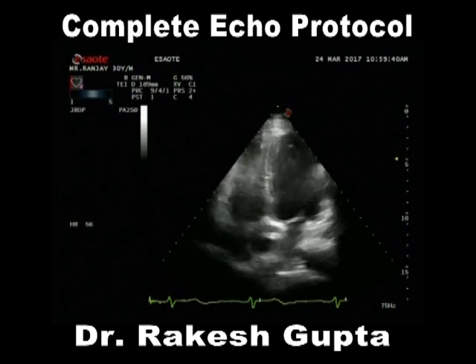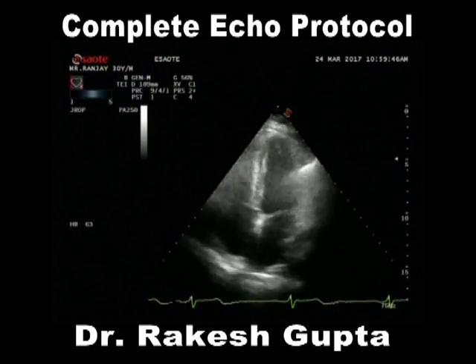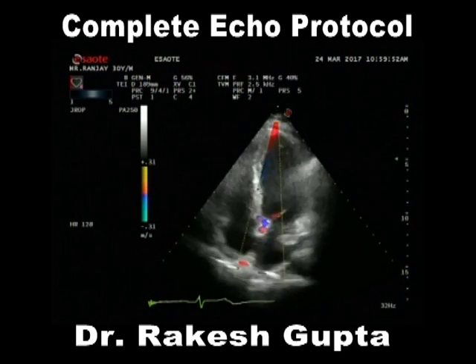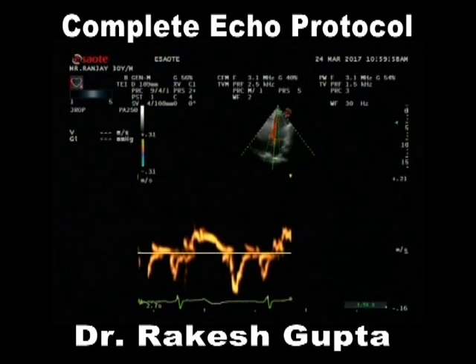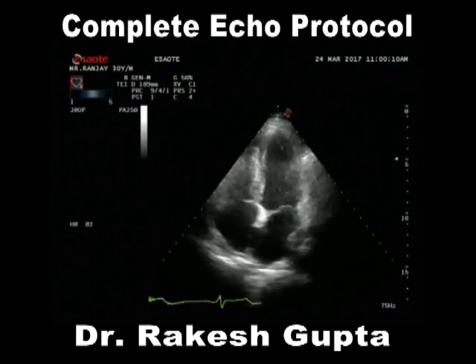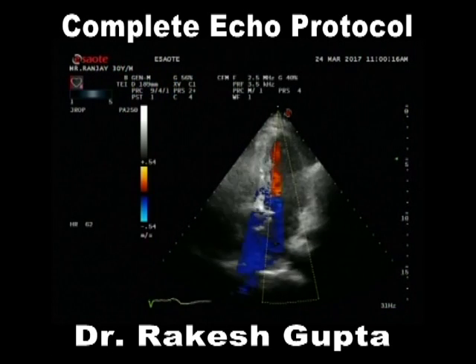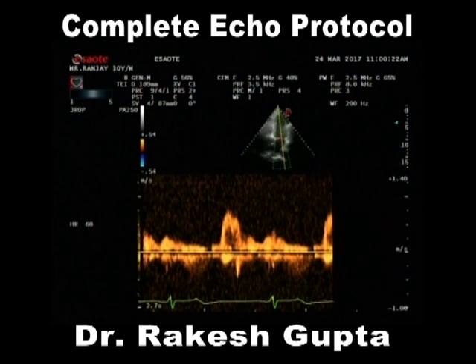Once I have done all these measurements, the most important measurement of what? Anything left? Diastolic dysfunction, man. The most important thing is we look at a septal TDI. Here is the septum. Here is a lateral wall. And by taking an average of those two and utilizing the E wave, we get what the E to E prime average ratio is.